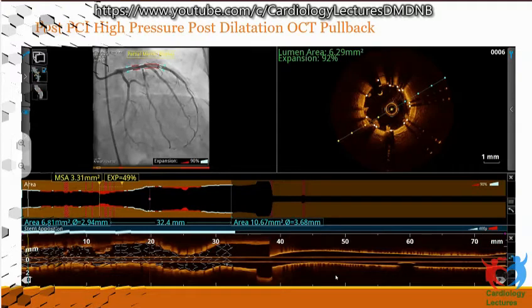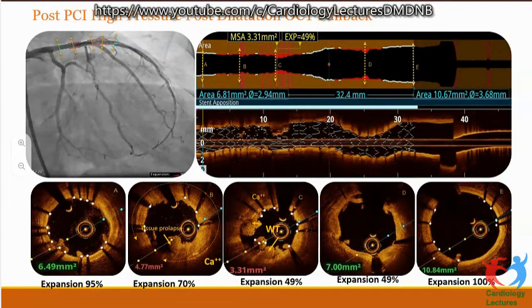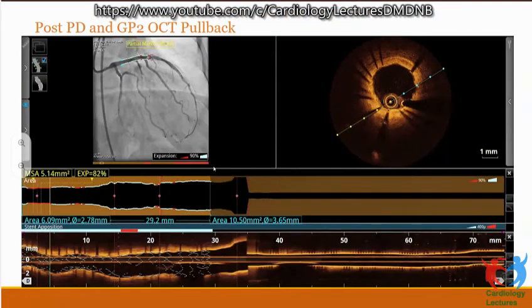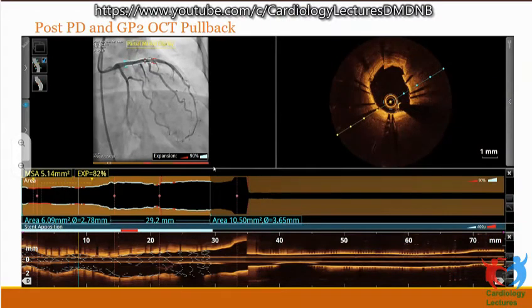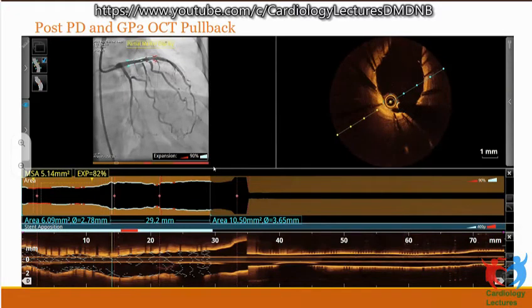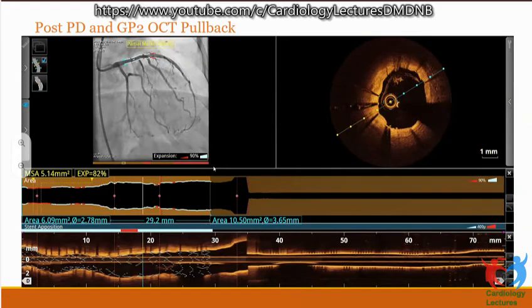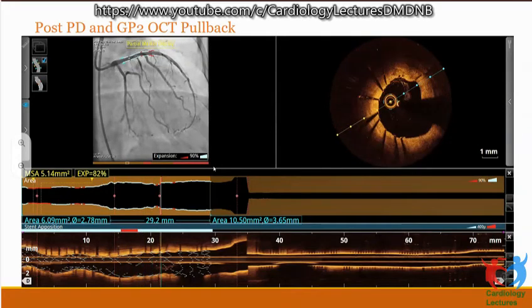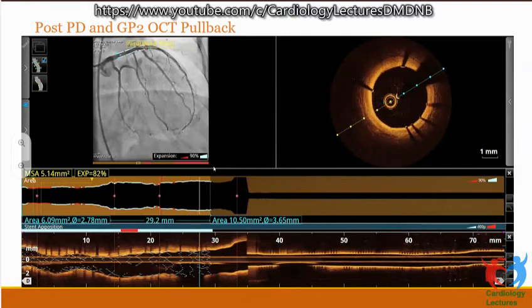So this patient had a lot of white thrombus in this. We gave a GP2B3 inhibitor and then took a run again. There was considerable dissolution of this white thrombus. So you need to resort to these things, and you need to wait on the table to see. Maybe the antiplatelets were not working well in this. Each case offers a different set of challenges and you need to think and provision then and there.